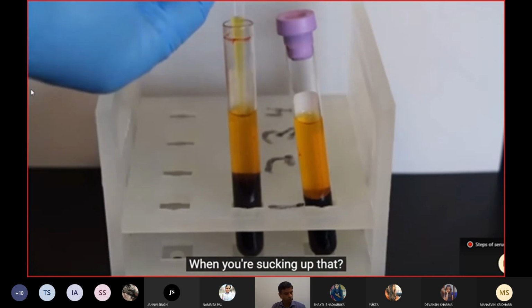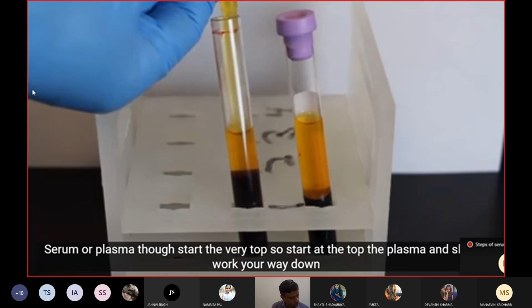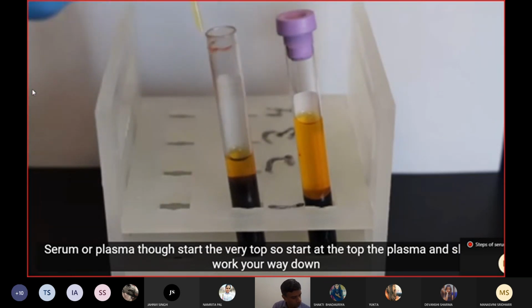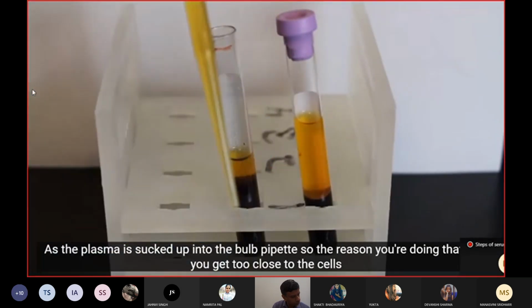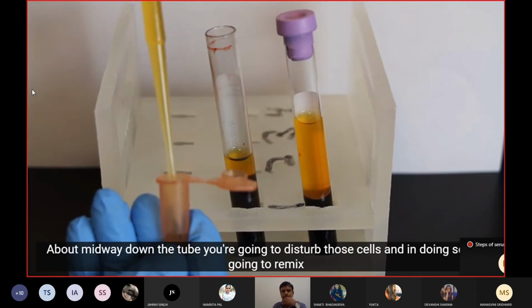All right, so when you're sucking up that serum or plasma, though, start at the very top. So start at the top of the plasma and slowly work your way down as the plasma is sucked up into the bulb pipette. So the reason you're doing that is if you get too close to the cells about midway down the tube, you're going to disturb those cells.